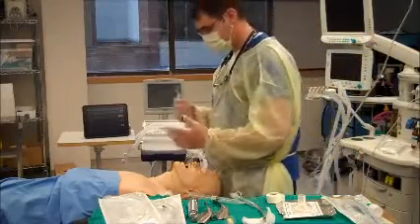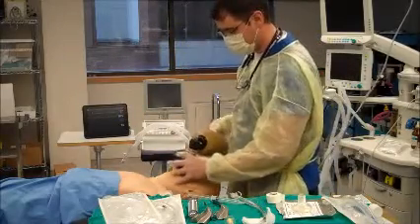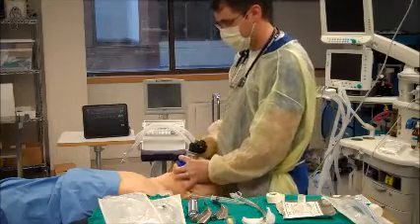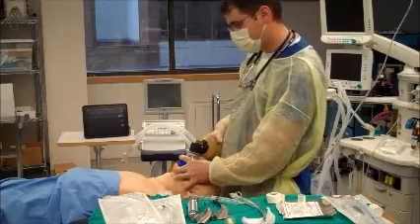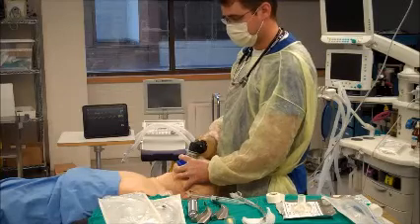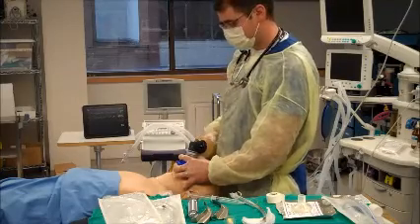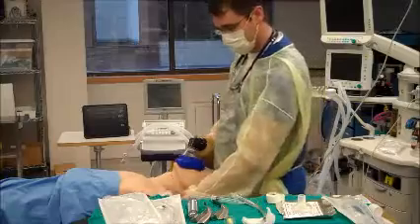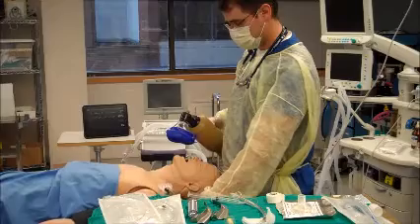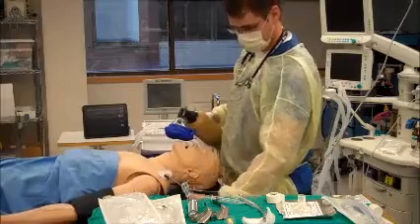I'll take my resuscitator bag and establish bag-mask ventilation using the proper CE grip, pulling up on the mandible and pushing down on the bridge of the nose. Verify chest rise and watch my saturation to ensure oxygenation is established. Ideally the patient's position should have the nose about the level of the xiphoid process, so I'd get an assistant to elevate the table to increase the physician's chance of success.